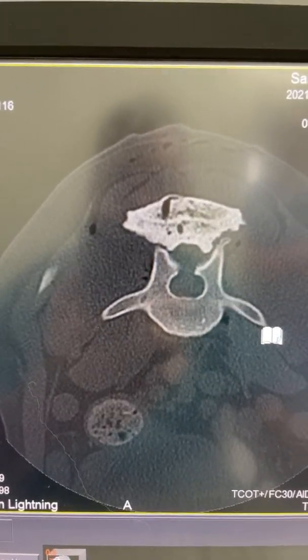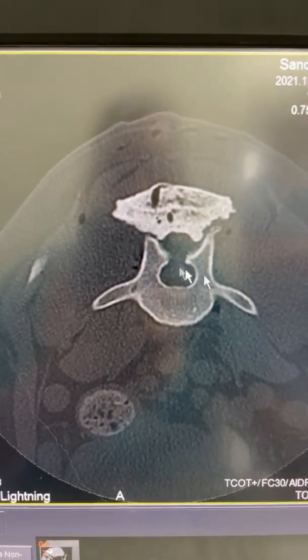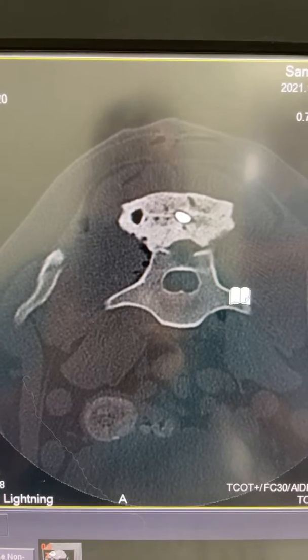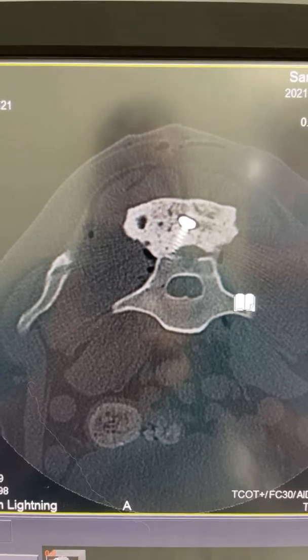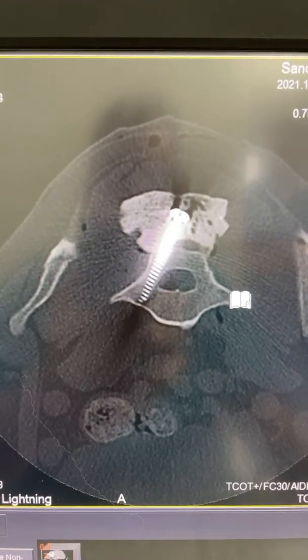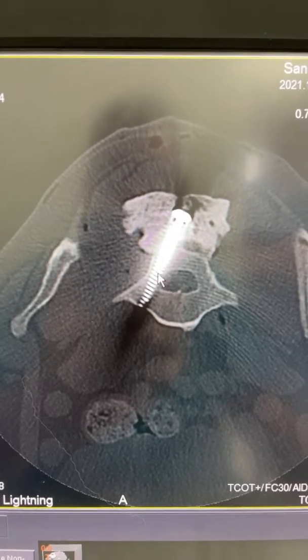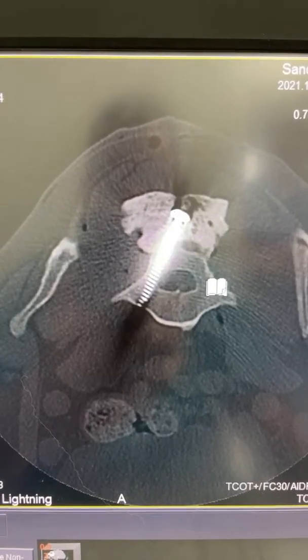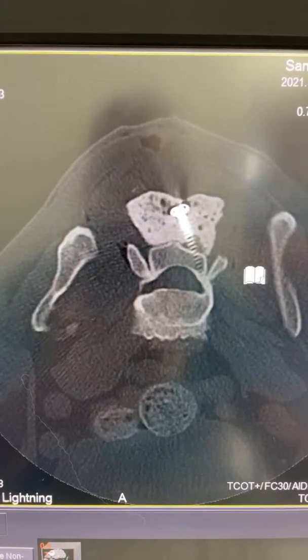Heading into the body of L7, we can see our dorsal laminectomy right here that we used to insert our stifle distractor. Heading farther back, that first screw is perfectly situated within the corridor in the body of L7, and the other one is again perfectly situated in the body of L7.